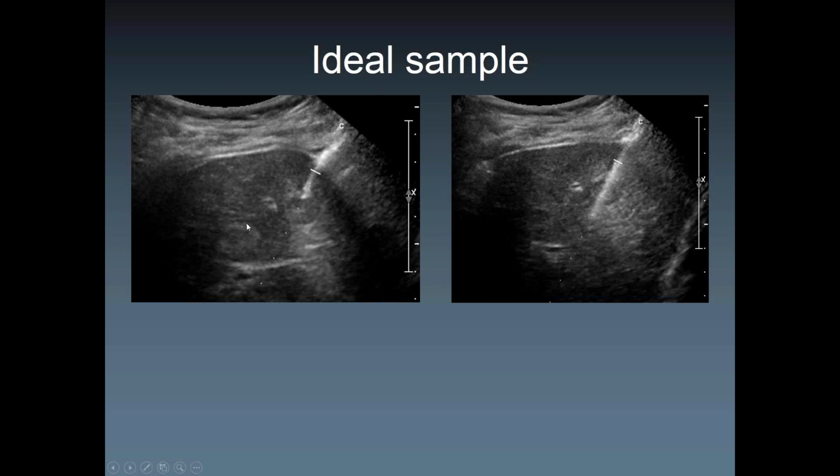And what is it typical for? Well, it's typical actually for hemangiomas, right? But mostly for larger hemangiomas, like 2 centimeters or larger, that's considered large. But you can have obviously mets that do the same thing too. Nevertheless, that's the target, this one here.